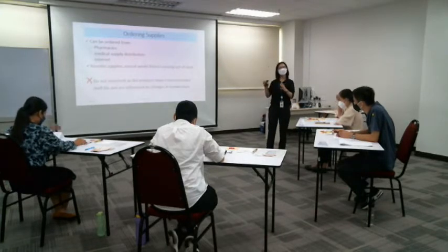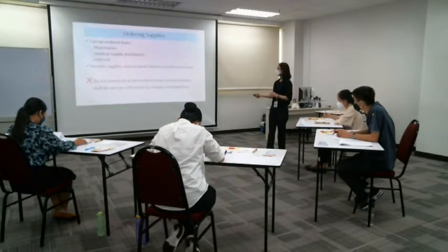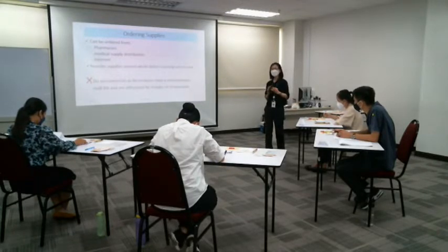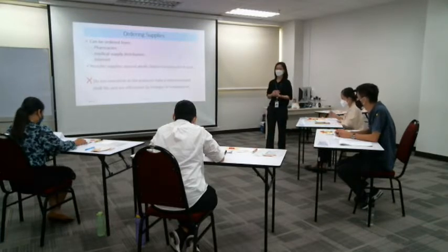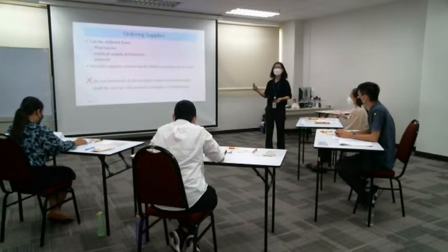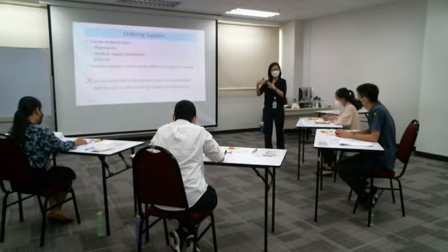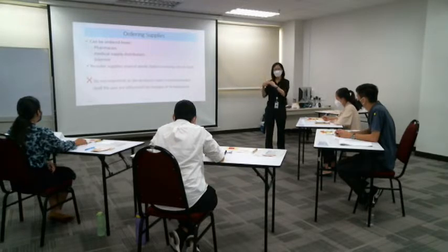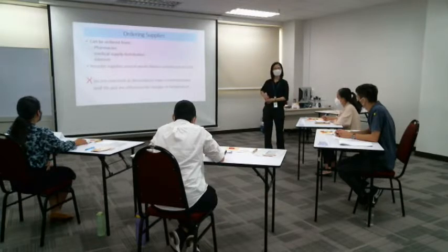Because sometimes you go to the pharmacies, they may not have the ready stock for you. Right? So the patient also shouldn't use it until the last piece. When it is going to finish, then they can go start shopping for it. And if it is ordering online, it takes time for delivery. So remind patients on this point, so that the supply will not be discontinued. This is also taking care of the quality of life of the patient, because it is not controllable, right?